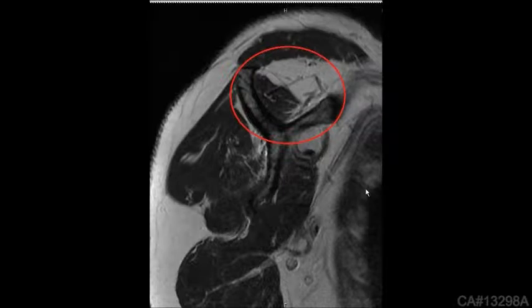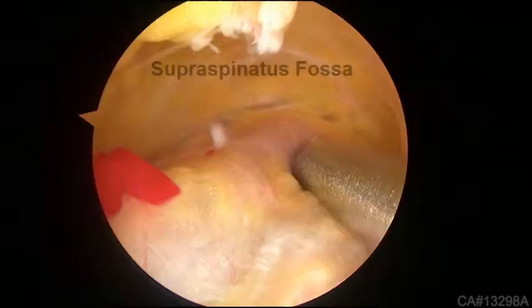Fat atrophy is easily graded on sagittal MRI images and correlates with what is visualized arthroscopically.